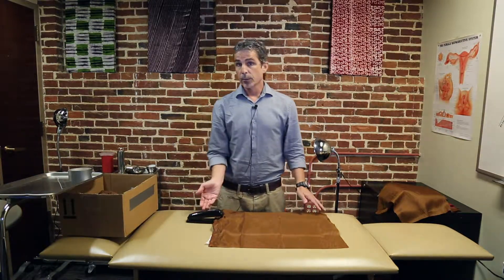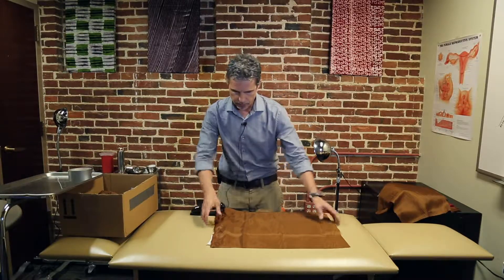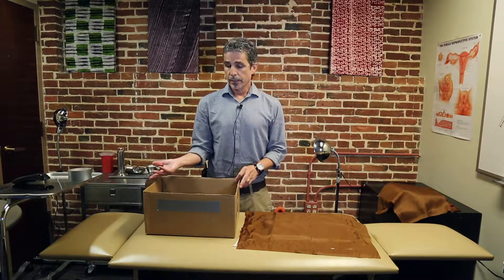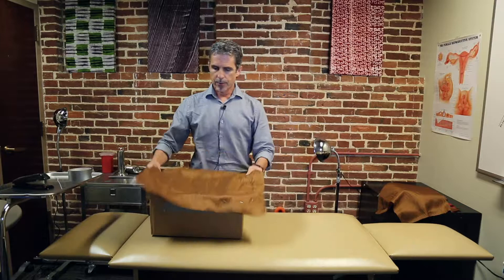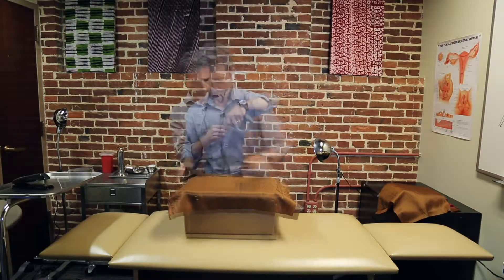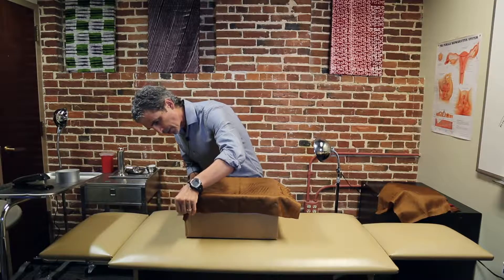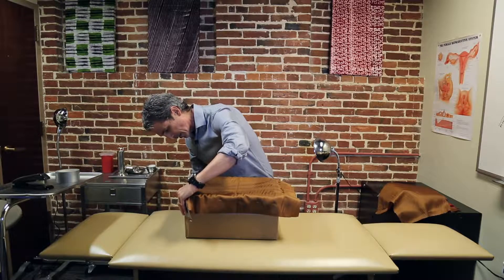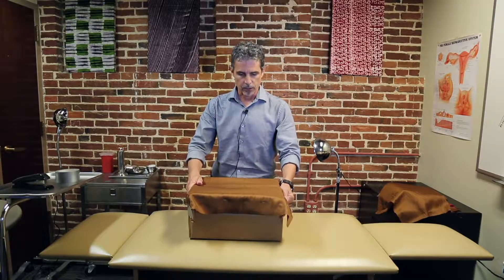Now we're going to go ahead and staple the layers together. Make sure you get all the layers through and just keep moving across. Then we place the layers on top of the uterus, making sure you know the position of the fetus for your delivery. Once placed, secure the layers with duct tape. Having a second person is usually helpful, but you can start it yourself on one end — get the duct tape halfway on the material and halfway on the box, then pull it tight so you have some tension on it, making it easier to cut through.